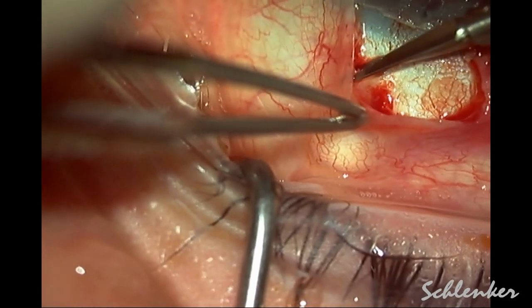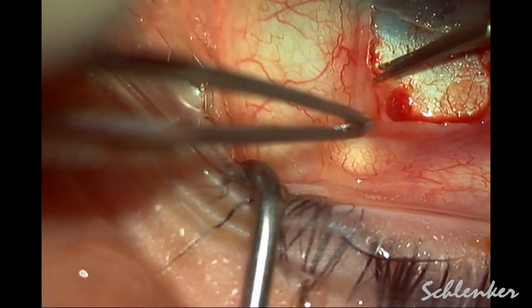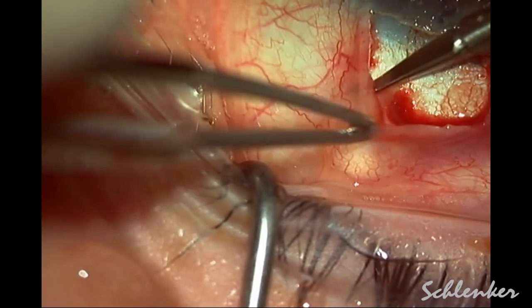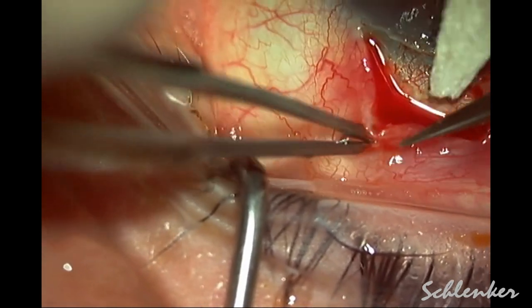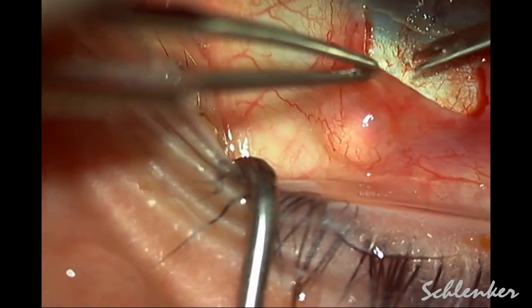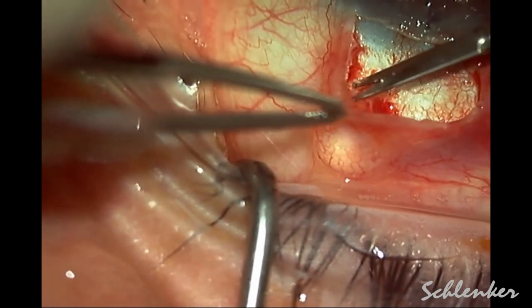Part of the informed consent process should include having a backup procedure — for instance, a trabeculectomy in the area, another Xen, or potentially a tube shunt — given the fragility of the micro stent. As you can see here, we are dissecting.